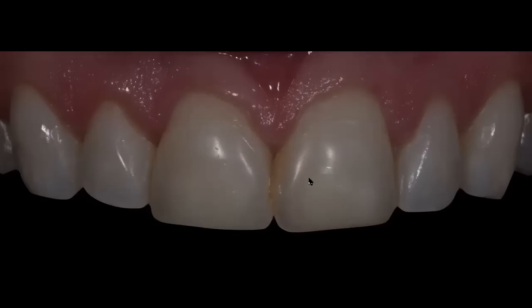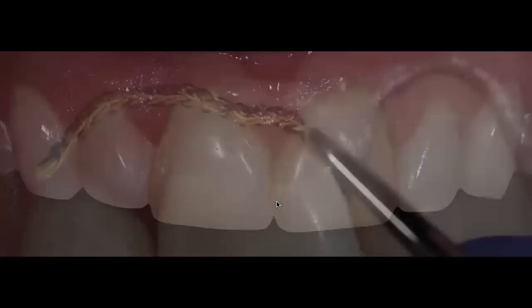The line angles are not the same on 8 and 9. You can see that one tooth appears to be wider than the other. You can actually see the margin or the transition line between the composite and the actual tooth structure. So definitely, we can all agree that these restorations need to be changed. So that's what we're going to do for the patient. We're going to get her in to change both of these restorations.